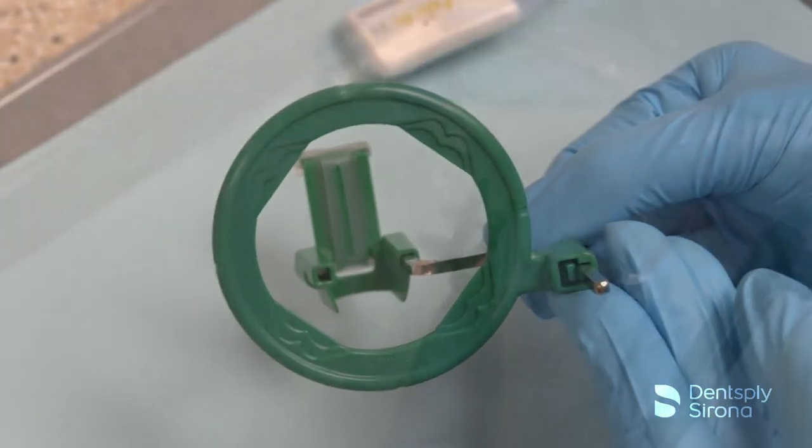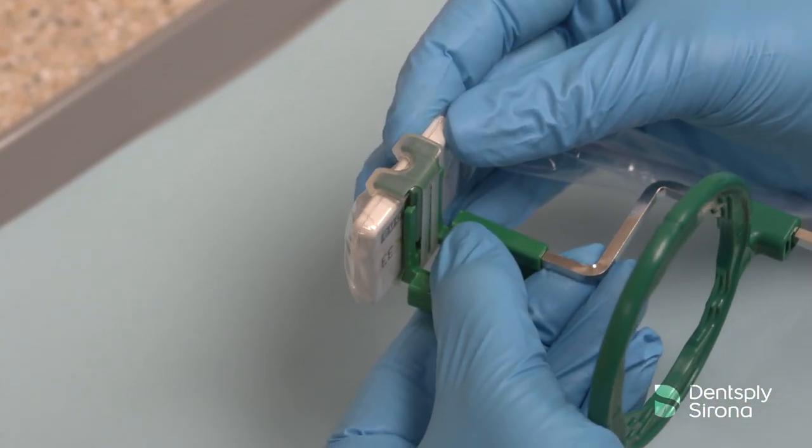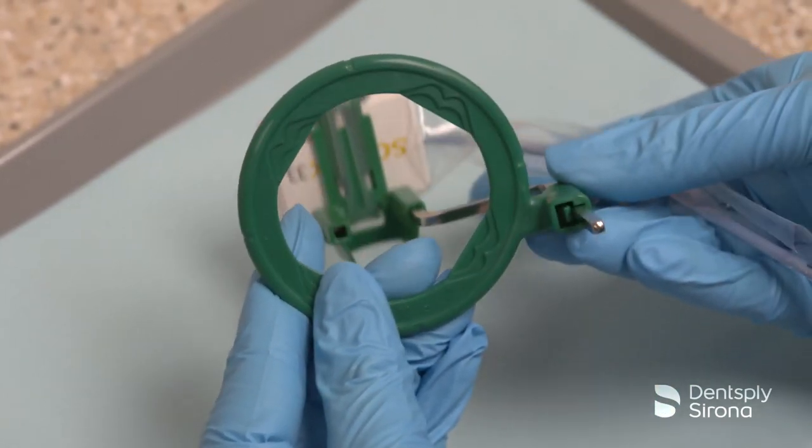After placing the sensor into a RIN digital sensor cover, securely insert the sensor horizontally into the green bite block, making sure the active side of the sensor is against the flat surface of the bite block.